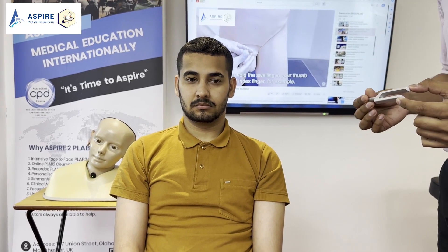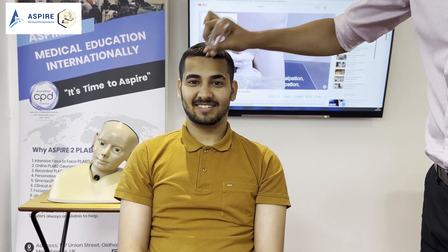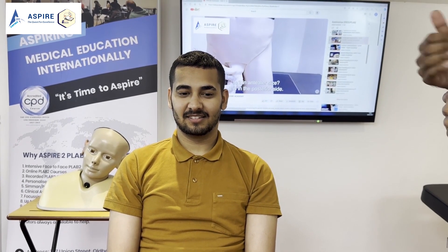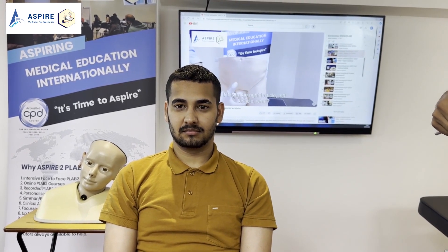Let's confirm it by doing Weber's test. I'm going to buzz it again, John, and this time place it on your forehead. You just have to tell me which ear you can hear better — left or right — or if you don't hear at all, or if it is the same on both sides. Okay, left side. So: air conduction more than bone conduction in the right ear, bone conduction more than air conduction in the left ear, and Weber lateralizes to the left side — so the patient has got left-sided conductive hearing loss.